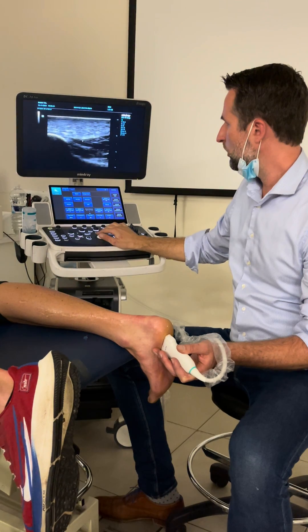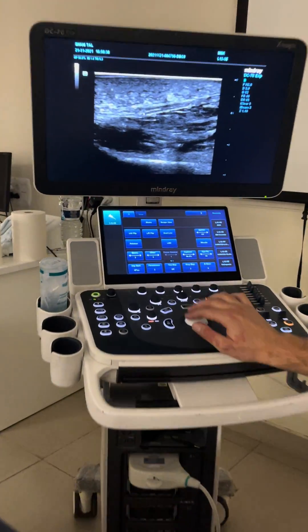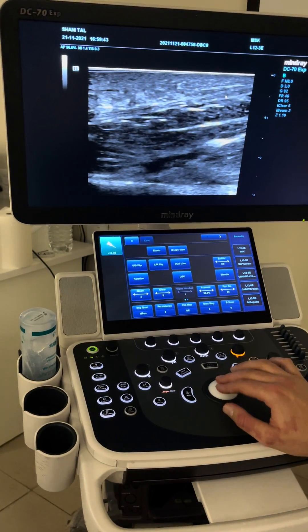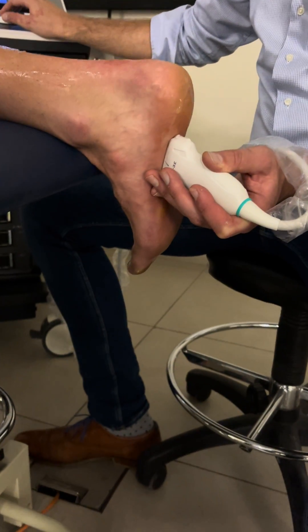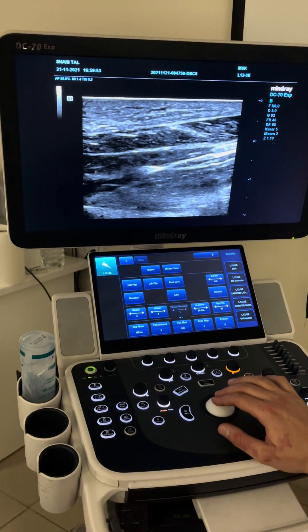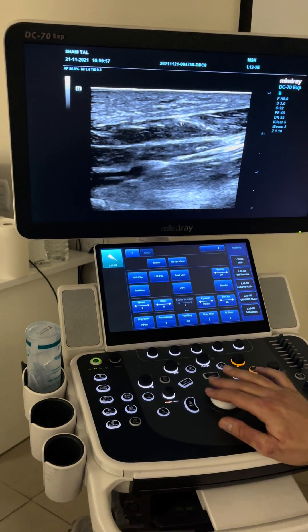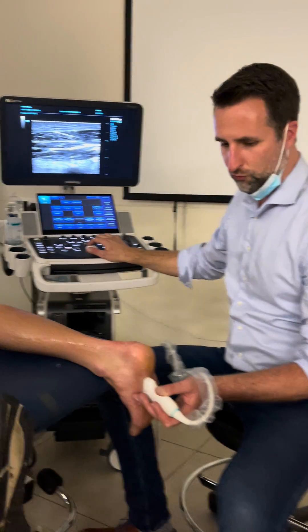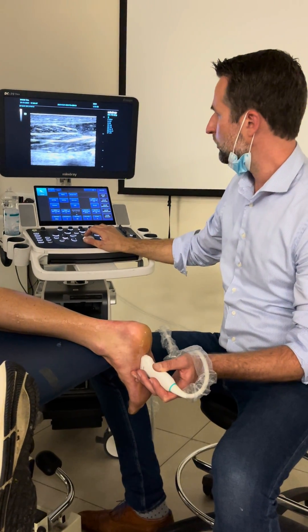From here we go a little bit distally. We see the fascia here going upwards — this is still the fascia, becoming more superficial and thinner because it's spreading out. Below it you can see the intrinsic foot muscles. If you do a little flexion and extension of the toes, you see they are attached to the fascia right here. In this location, quite far distal, this is where you can find plantar fibromatosis or Lederhosen disease.